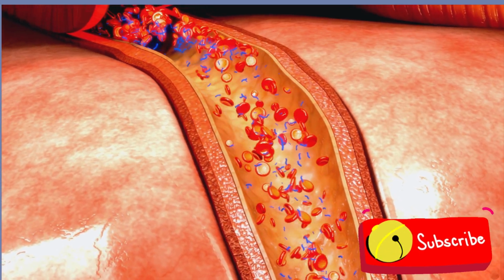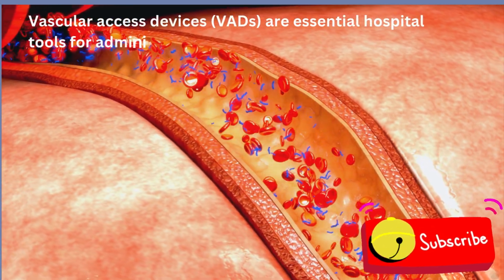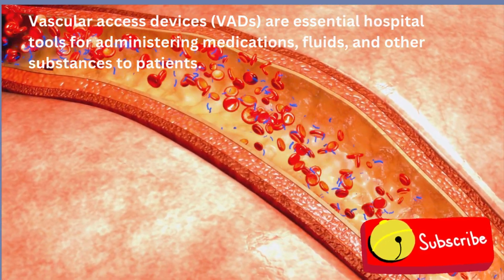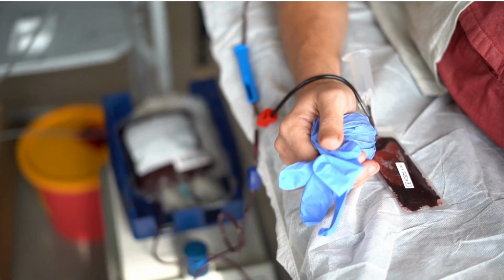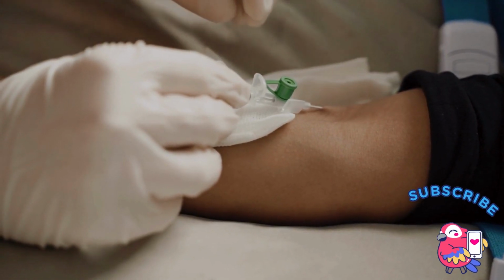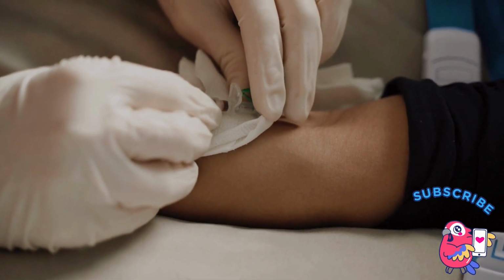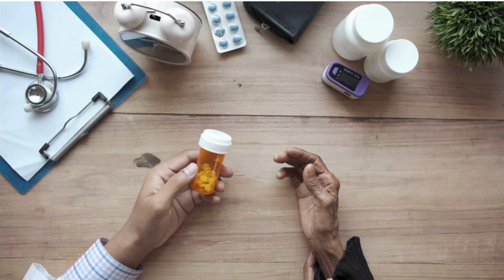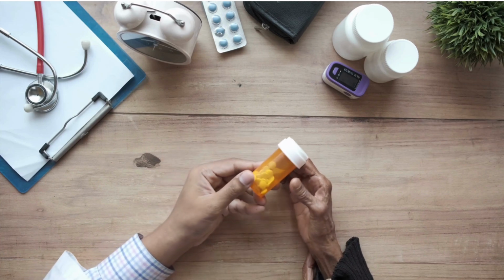Vascular access devices are tools or devices that we use in the hospitals for administering medication, fluids, and other substances to patients, depending on their type of care. This, in fact, was a big achievement in healthcare. It has led to a lot of benefits for the patient: a proper way of treating, and being able to communicate directly with the bloodstream, give the substance to the patient and deal with him.